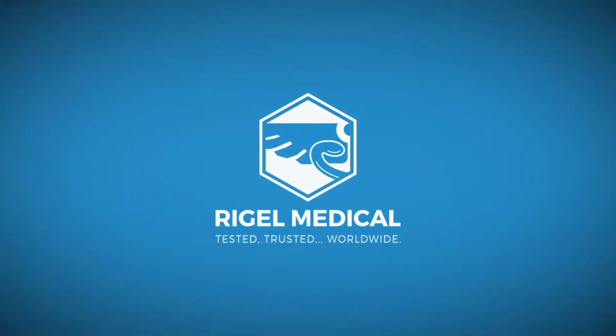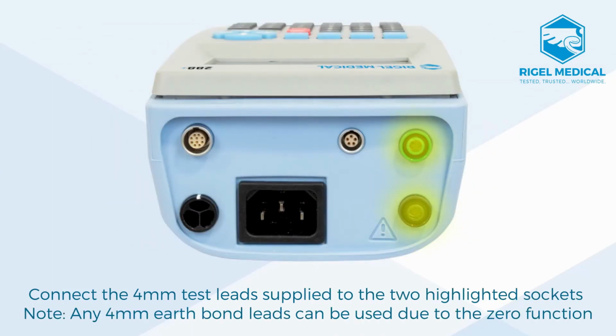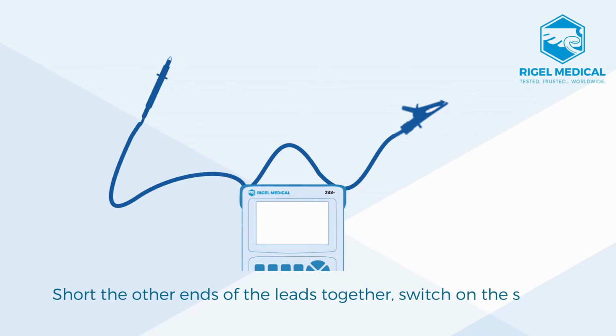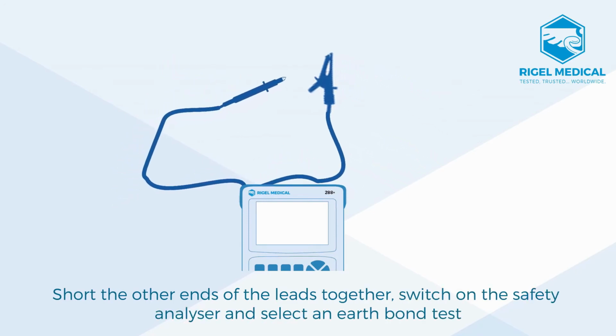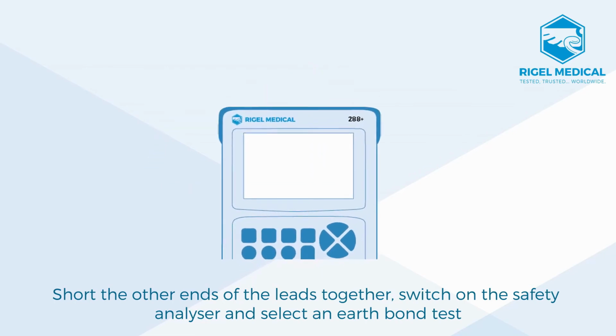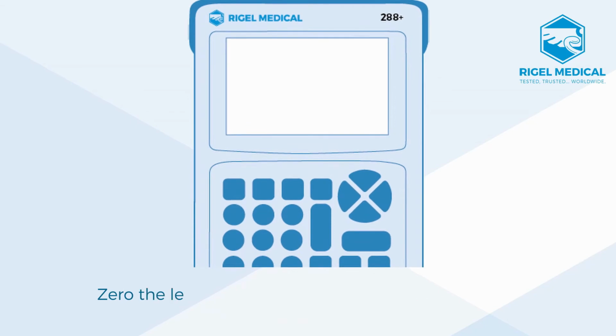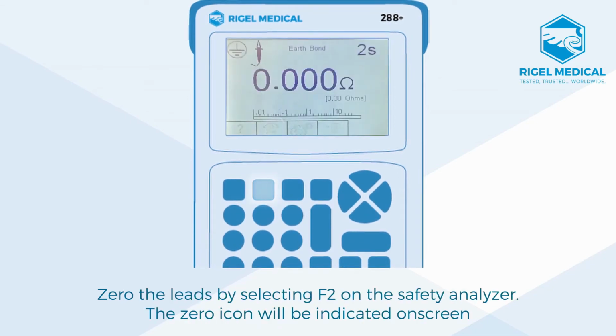So first we connect some 4mm test leads that's applied to the two highlighted sockets. Any 4mm earth bond leads can be used due to the fact that the Rigel 288 device has a zero function. And then what you can do is short the end of those leads together, switch on the analyzer and select the earth bond test. Because you've shorted these leads together, you can then zero them out using the F2 function. And the zero icon will be indicated in the top left once the zero has been performed.